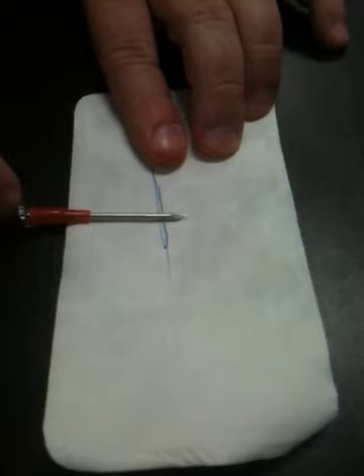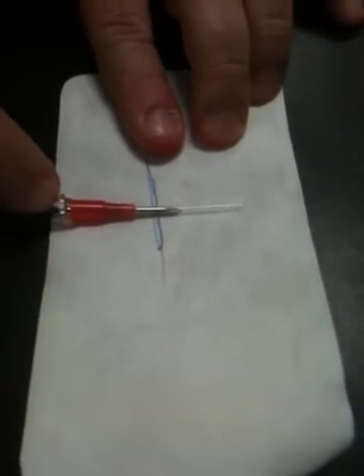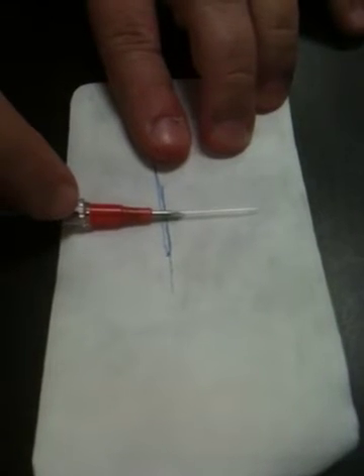So therefore, look at the end of the needle. It's not moving, but see the cannula is going on up in the vein. And we're feeding it off.